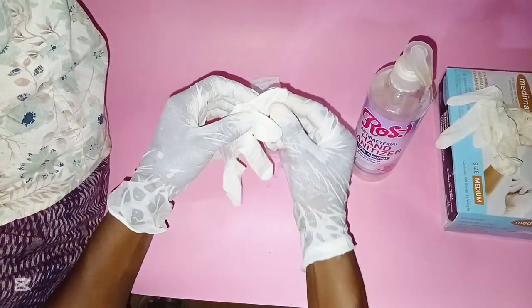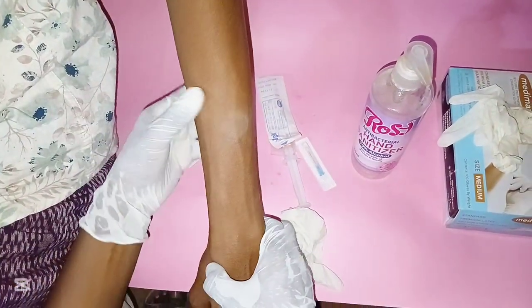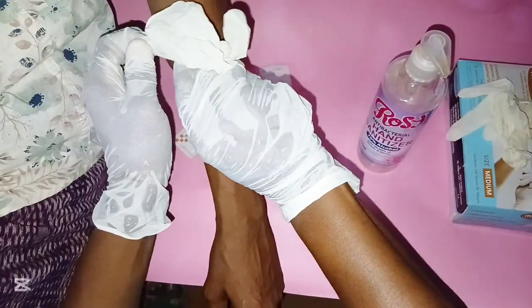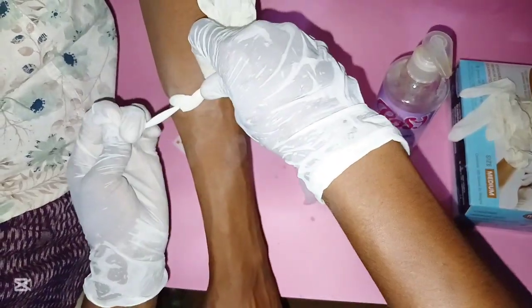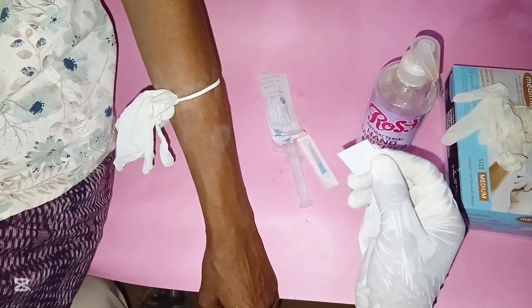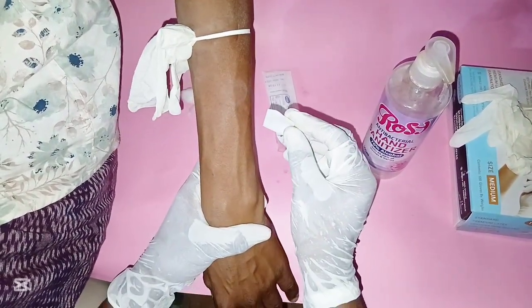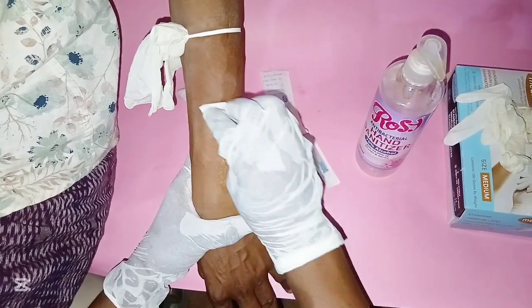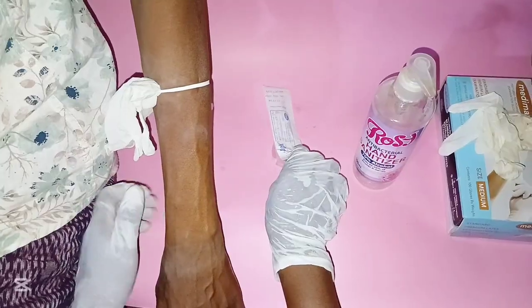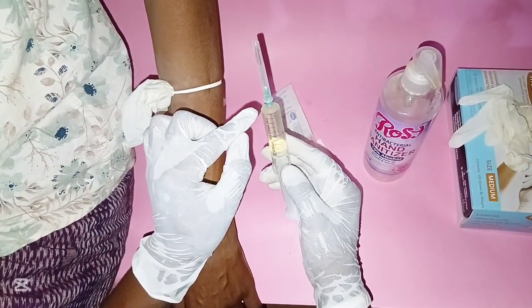Get a tourniquet and apply it to the patient's arm. Get an alcohol swab and clean the vein with the alcohol swab.